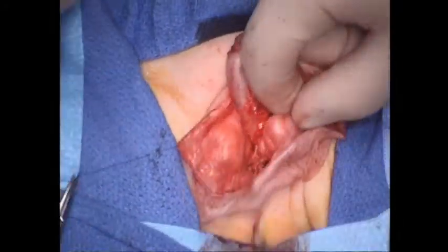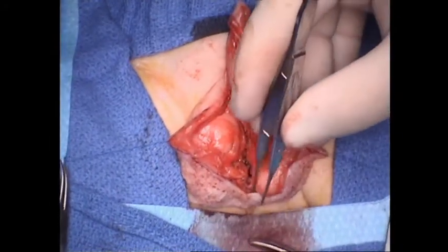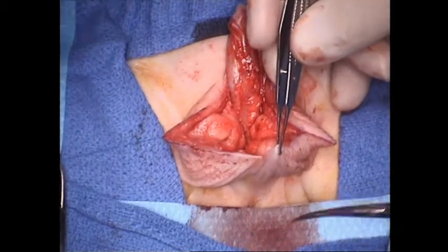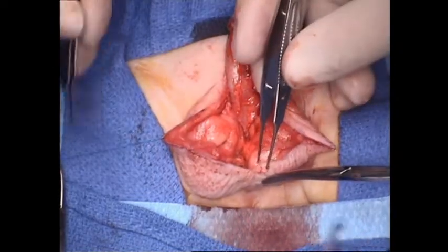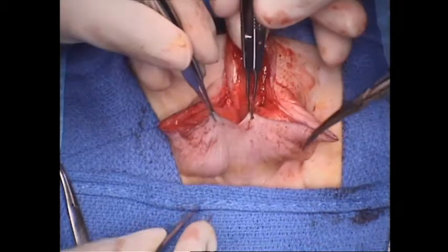I think I may benefit from opening this just a bit more. And you could see with this dissection how much further I could secure the penis up to that drape. So we've really made great progress in terms of length that we've gained.